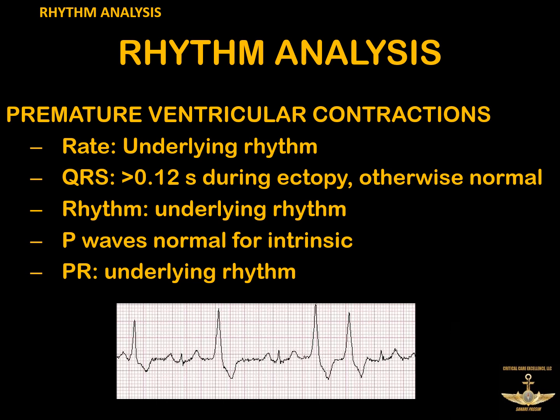The value of the PVC is its clinical indication that something else is wrong. Usually what a PVC is telling us is there is some kind of ischemia somewhere in the heart. So PVCs are relatively common with certain kinds of heart attacks because you have a big ischemic area in the heart, and one of the ways that your heart protests against being ischemic is that it starts depolarizing certain places before others and spitting out these ectopic beats. Now, the ventricles being the biggest chambers, they're the most likely to be prone to this.